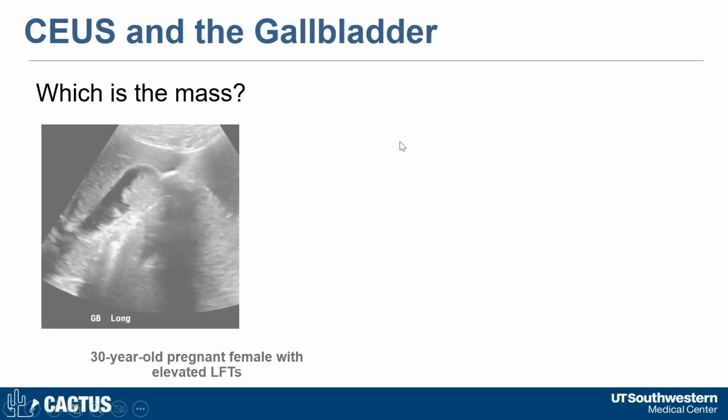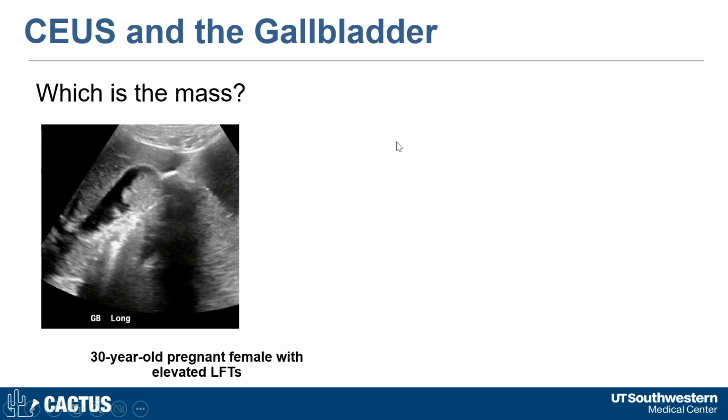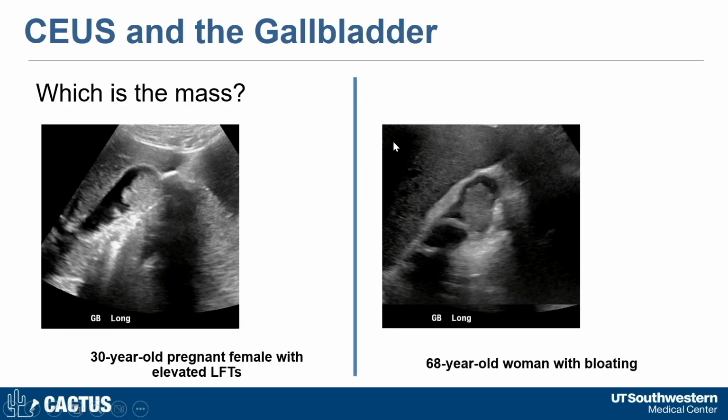I'm going to start with two cases. A 30-year-old pregnant female with elevated LFTs in this grayscale ultrasound, and this 68-year-old woman with bloating in this ultrasound. Which one, if either, is a mass? And we'll come back to these.